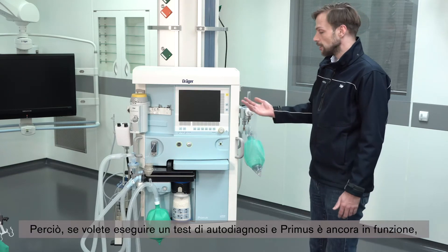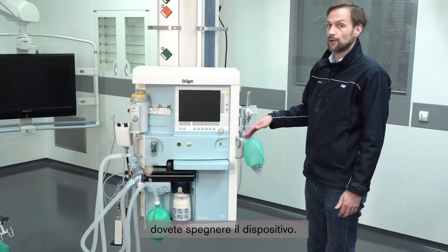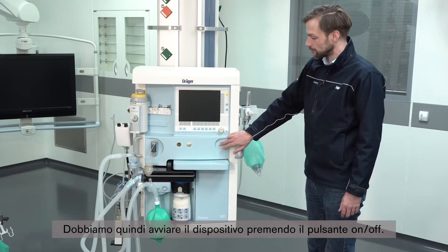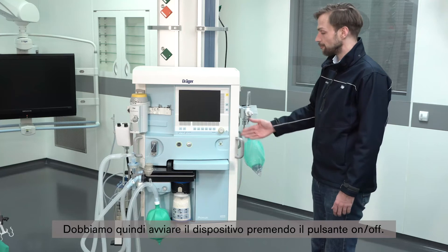If you want to perform a self-test and the Primus is still running, you have to turn off the device. In this case the device is already off, so I have to start the device by pressing the on and off button.